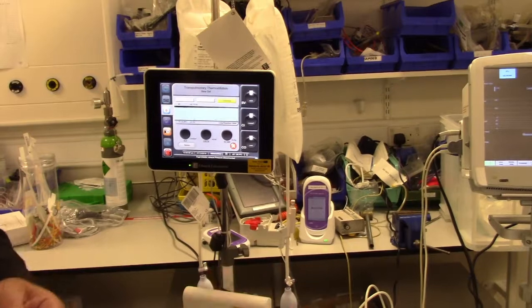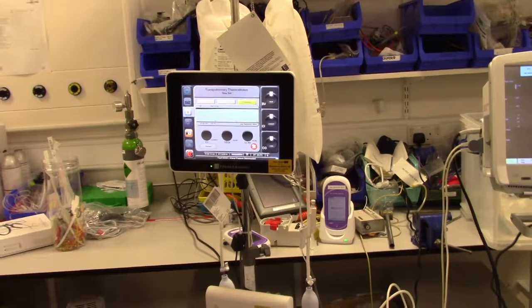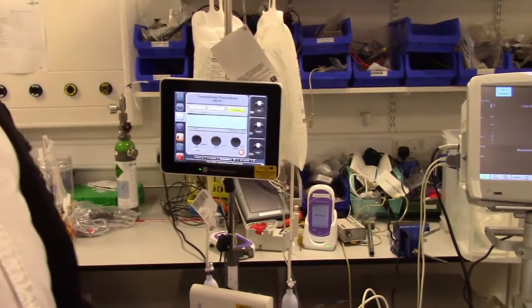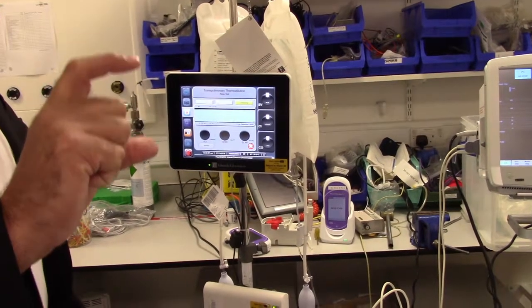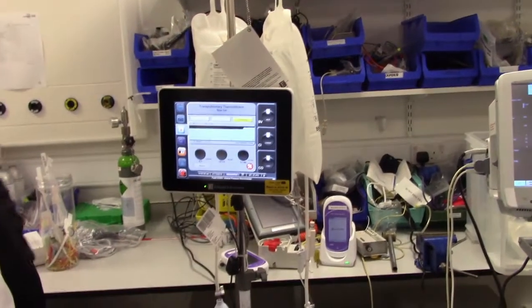The only consideration you might have is the volume that you're giving to the patient, if you don't want to give them volume, for example a renal patient. Put them on the filter. Bear in mind though, 250 mils is only a cup of water. I understand what you're saying, but at the same time, you can revert to 10 mil injections on this. It actually is still very small.